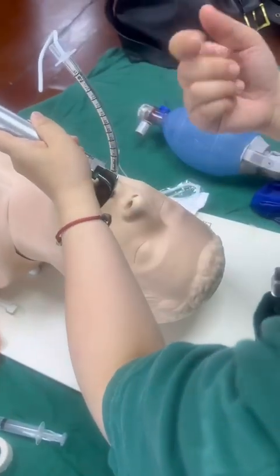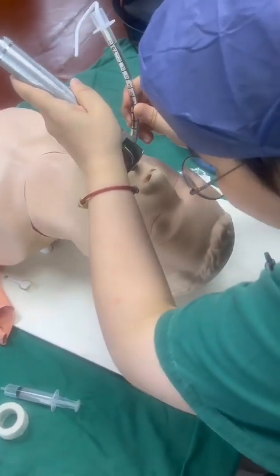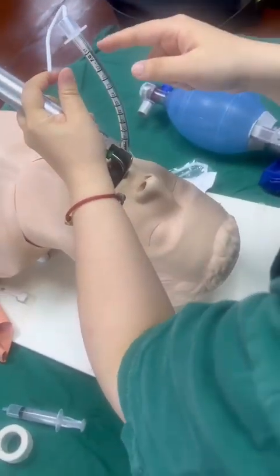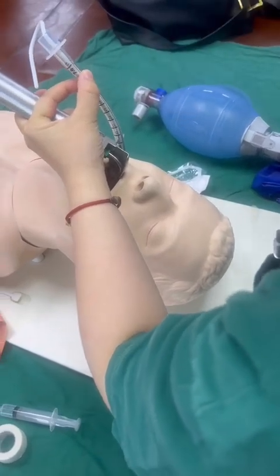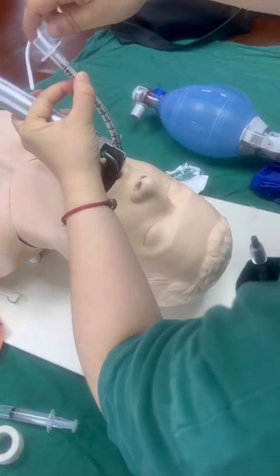The teeth are broken, because we rotate our wrist. So only lift. When the tip of the tube is inserted into the glottis, we can ask the assistant to remove the stylet.